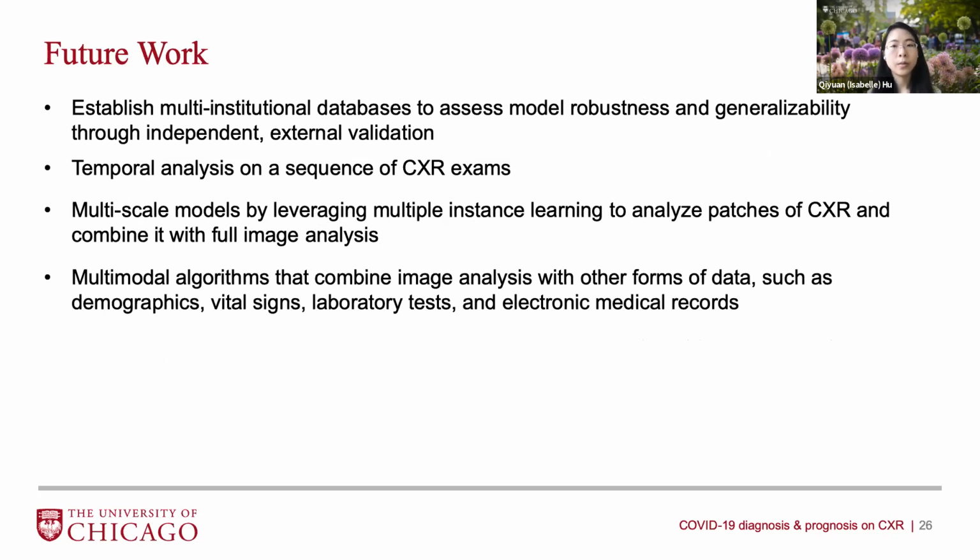In future work, we will continue working on establishing multi-institutional databases that contain diverse populations and different imaging acquisition protocols and machines in order to assess the model robustness and generalizability through independent external validation. I know that MIDRC has been establishing a multi-institutional database, and we will continue to contribute our data to the effort.